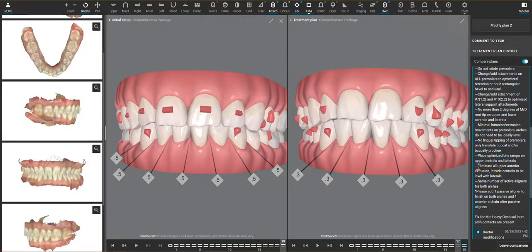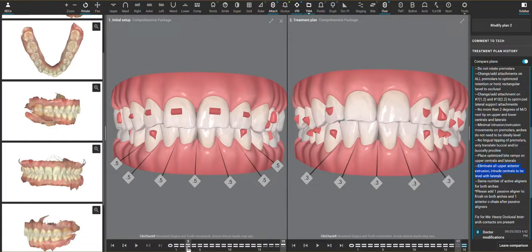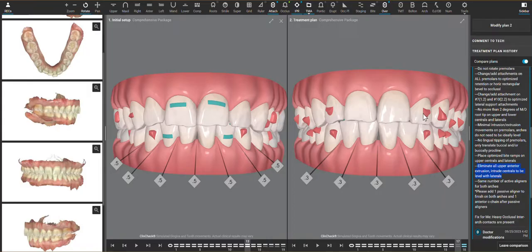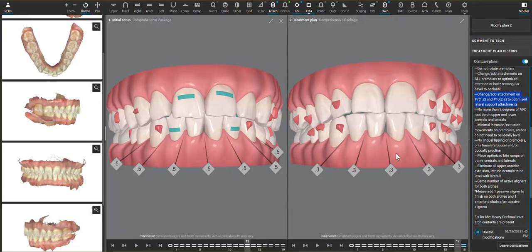So this is how I ask for eliminating the extrusions, and then if I'm going to be doing even just the slight bit of intrusion of the central incisors, then I still want to ask for these same optimized support, or sometimes they're called optimized retention attachments.